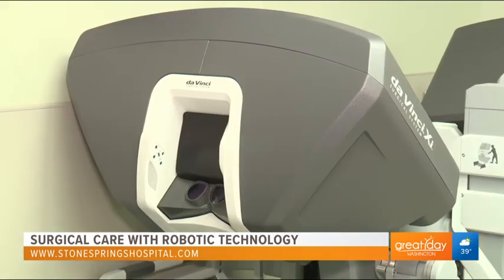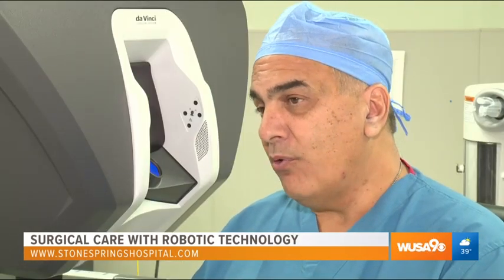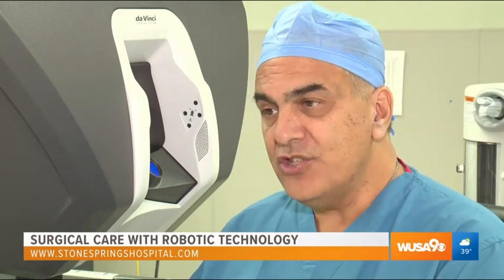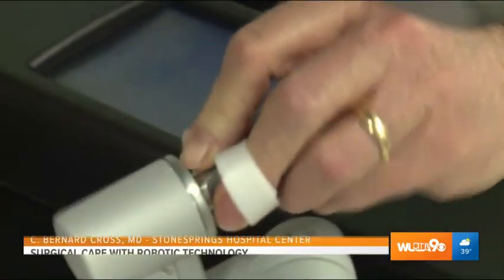What you're actually able to do is have high definition vision, which allows you to see what you're doing, and therefore if you know the anatomy and know the tissue planes, it makes all the difference in the world. It's easier to do complex surgery with the robot than laparoscopic in my point of view, and a lot of people think that way. And it can also allow us to do more difficult cases we wouldn't even have attempted laparoscopically. Now we can do that on the robot, with the advantage then we can offer more minimally invasive surgery to our patients, which I think is a great thing.